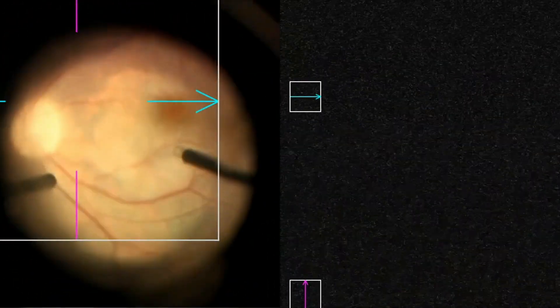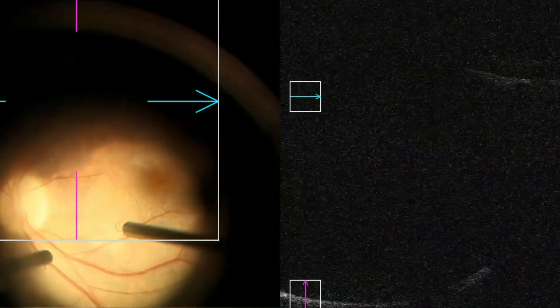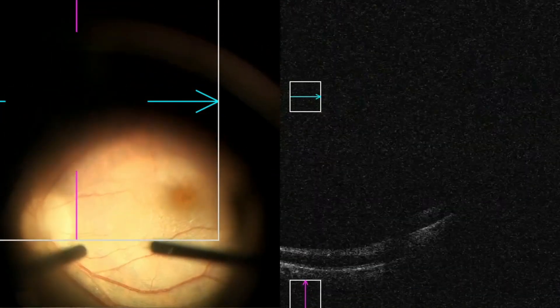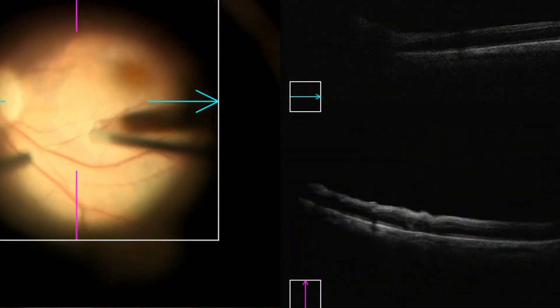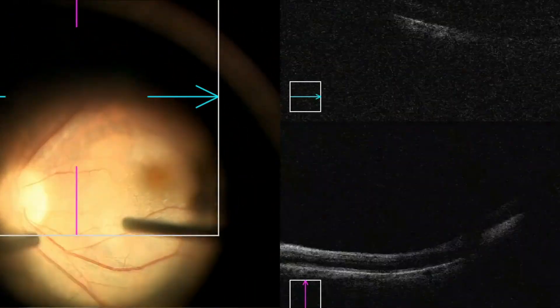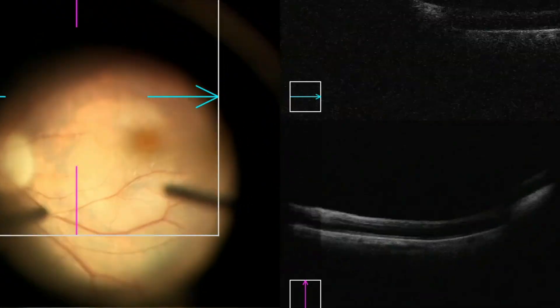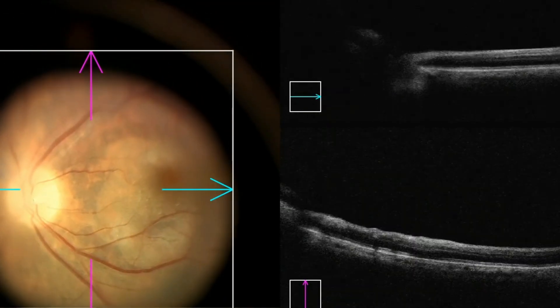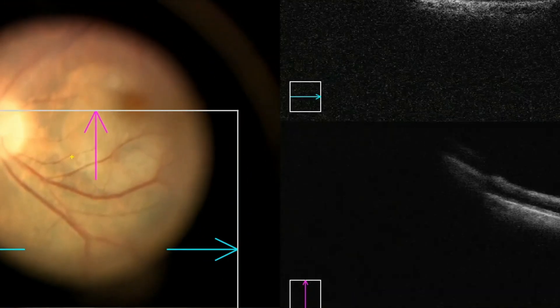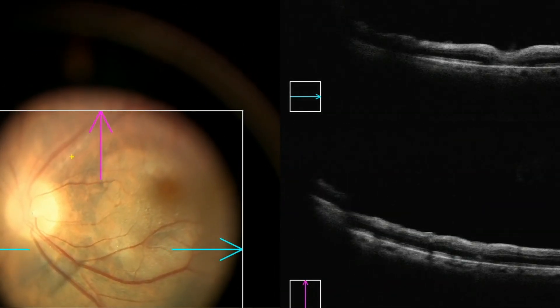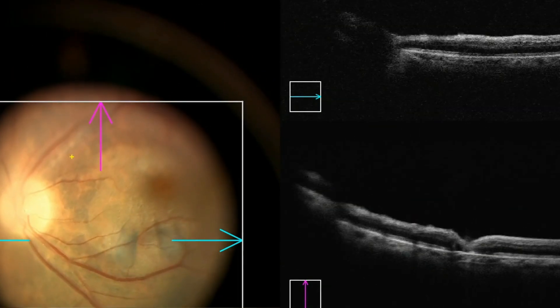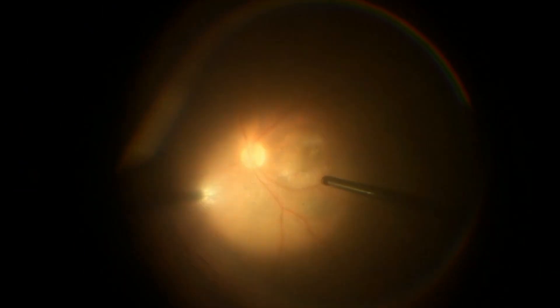Going back to the intraoperative OCT — you can see the bubble is still there. This is in the supranasal area, which is also a region where you might be able to watch it a little bit. It's not in the fovea, but it's definitely within that papillomacular bundle area, and we don't know to what extent the toxic effects can extend. We're taught that these eventually just migrate posteriorly and centrally. I'm assuming the surgeon's goal here is just to make this the last surgery this patient needs — especially since they're going in anyway for the oil removal. And it looks like they got rid of it there — they did the aspiration technique.